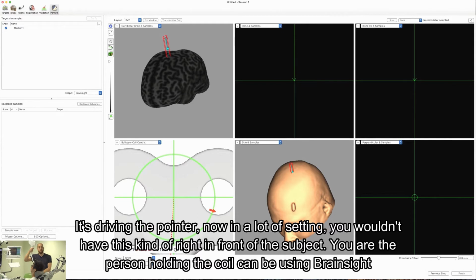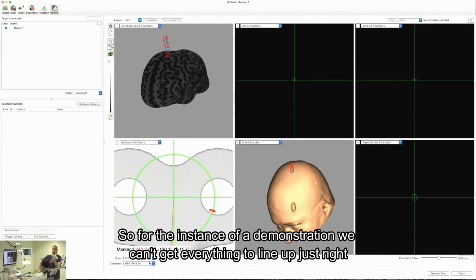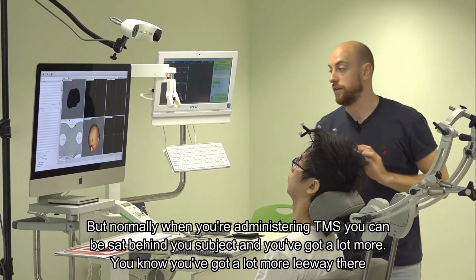So as this moves around the scalp, it's driving the cursor, it's driving the pointer. Now in a lab setting, you wouldn't have this kind of right in front of your subject. The person holding the coil can be using Brainsight. In your lab environment, you don't have to have your subject there as well, because obviously the leads for the coils are only this long. So for the instance of a demonstration, we can't get everything to line up just right. But normally when you're administering TMS, you can be sat behind your subject, and you've got a lot more leeway there.